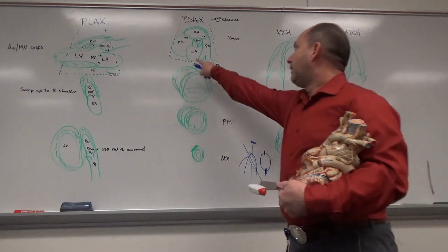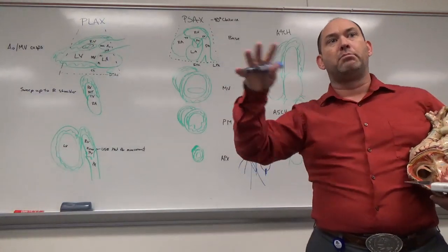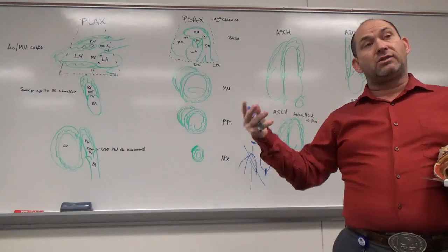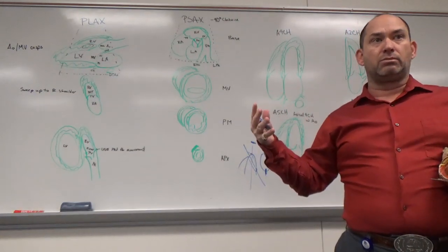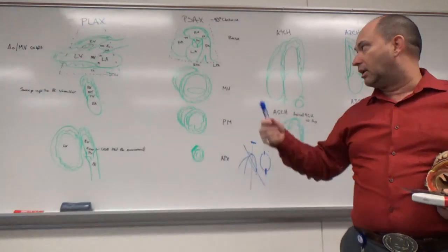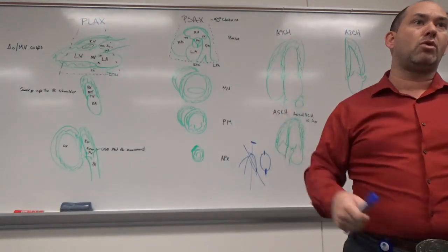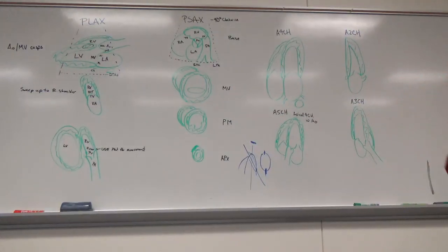If I see an atrial septal wall that looks like it's excessively moving, or bowed out or aneurysmal, chances are that's reopened that hole that closed after birth. In a young healthy individual, that should be closed. Then we've also got septal defects where it never closed and had a residual hole from the get-go. So there's two different types. One's a normal process that you acquire because of our great diets in America, and we get bigger, and things that cause problems stretch out our chambers. When you stretch a valve, what happens?